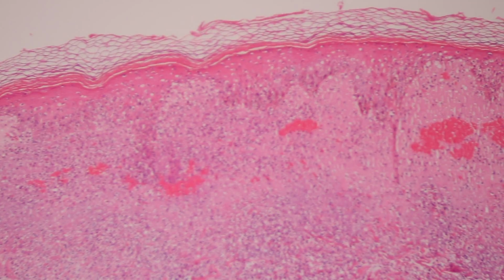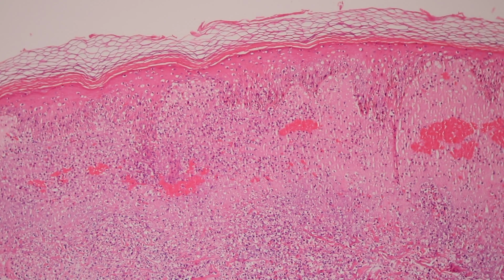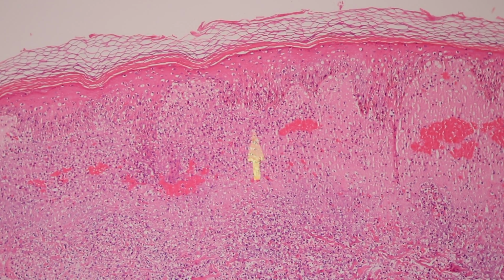But why I'm showing you this is because look over here. This is what's happening before the rupture. You can see an enormous amount of fibrin, blood, and neutrophil debris filling up this space underneath, and it's making a blister cavity that's on its way to rupturing. And look at the epidermis.